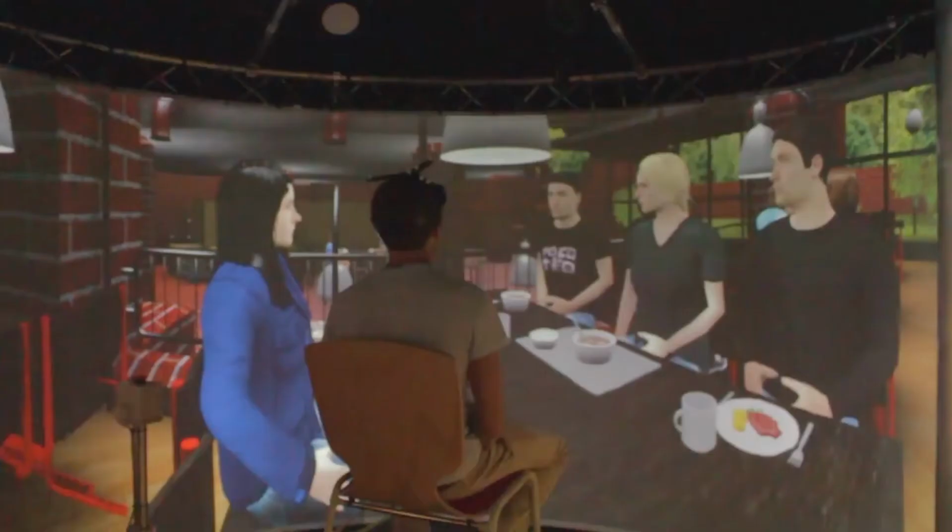In our laboratory in Oldenburg, we are adding extra layers of realism such as visual cues.